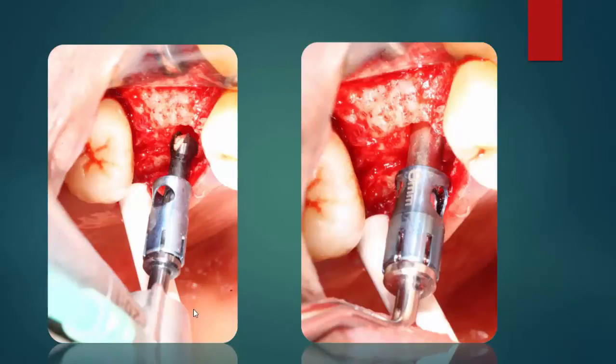This is one of my crystal sinus lift case. ملاحظ هون عم نستخدم السيستم اللي بيجي مع الستوبر. فنحن هاي الستوبر بتمنع إنه البير تدخل أكتر into the sinus، وبالتالي we minimize the possibility of the perforation of the membrane. حتى في عندك الهاند انسترومنت اللي هي الكوندنسر اللي مستخدمة ب condensing the bone graft إلها stopper كمان، وبالتالي تمنع إنه ندخل زيادة ضمن الساينس أو نعمل perforation للساينس.